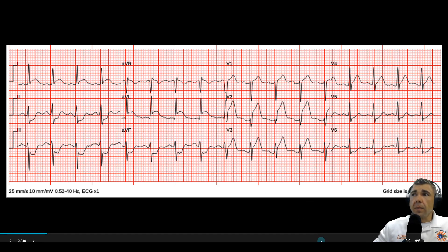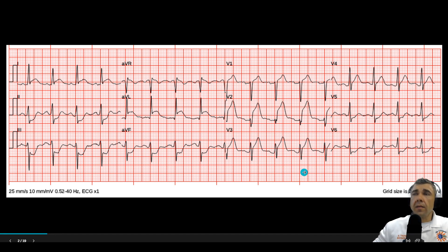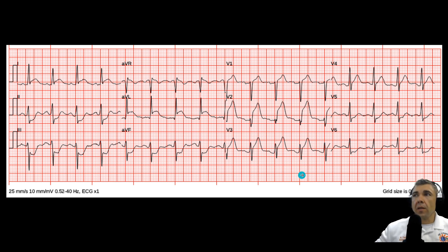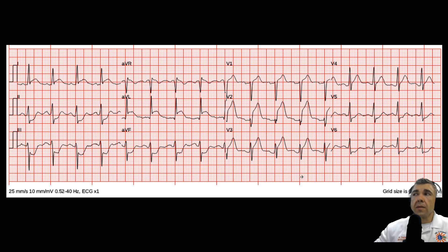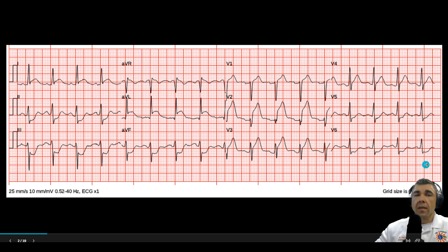A big LAD occlusion is most likely. I like to say that these anterior MIs — anything involving the LAD — those patients die fast. This would be the patient you would be ready to resuscitate, because those are the ones that go into V-fib. Be ready to shock them and provide resuscitation.